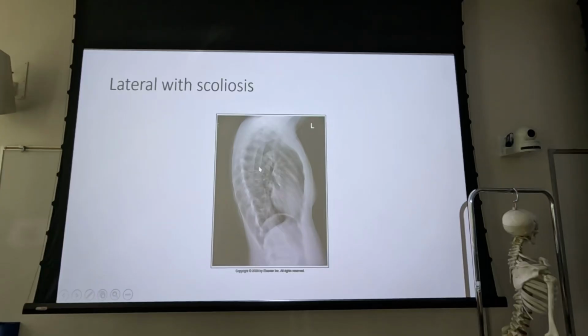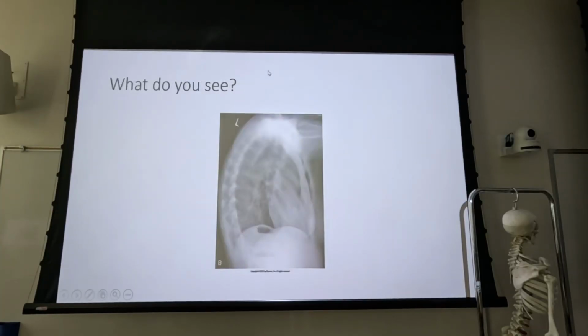Like the upper end here has no rotation. So if you tried to correct for the rotation, you rotated the patient to where the lower end showed no rotation, what would you have at the upper end? Rotation. So you just got to take what you can get with a patient with scoliosis. So lateral chest X-ray, we're looking at the posterior ribs. They're not superimposed. Depending on the patient's condition here, I might or might not repeat this. If this is an older patient, they're having a hard time standing up, and they almost need the grab bar this low for stability. Depending on the patient's condition, I might or might not repeat this. But by the textbook, this is not a good lateral, all right, because we've got rotation.